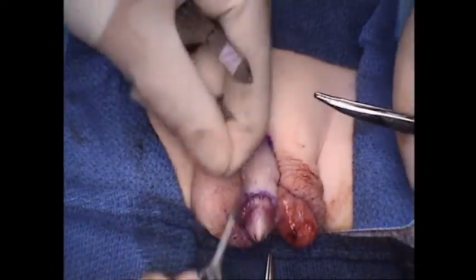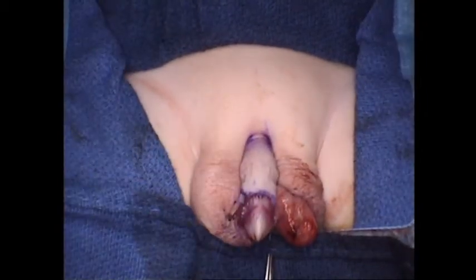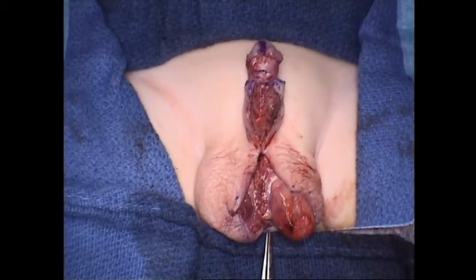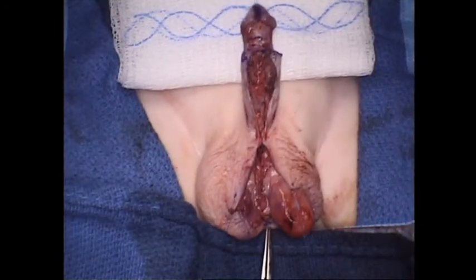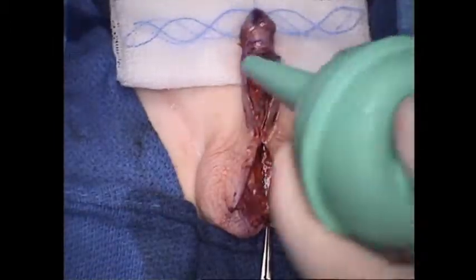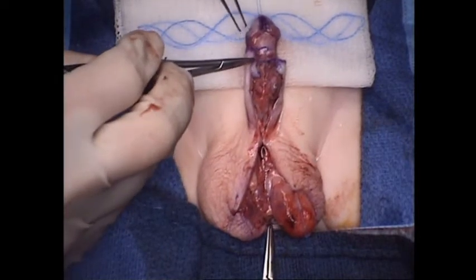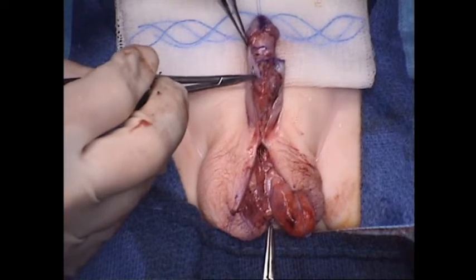So now we'll just continue to march along, sewing our shaft skin to the mucosal collar. You note that all of our sutures along this are subepithelial because we don't want to leave suture tracts in these patients. So we do a subepithelial suture. The exception to that is going to be up here along the ventral surface of the graft, where we sew the graft to the shaft skin. We'll actually make some epithelial sutures because we're going to be cutting through that at the next stage.